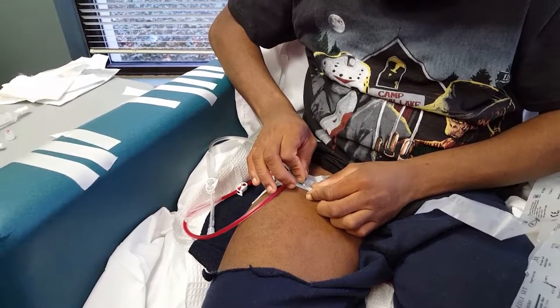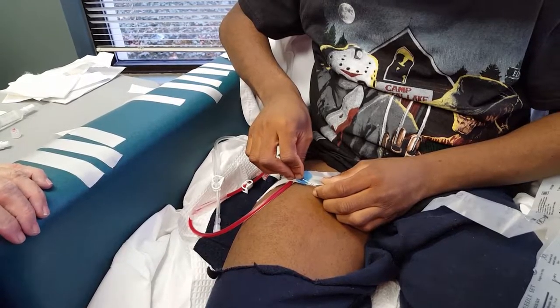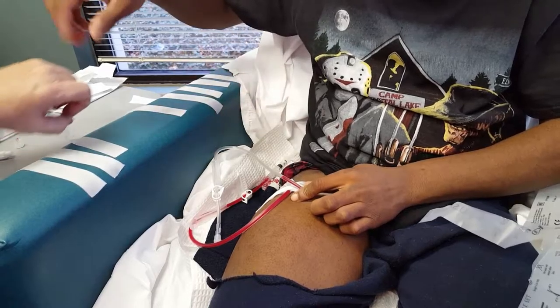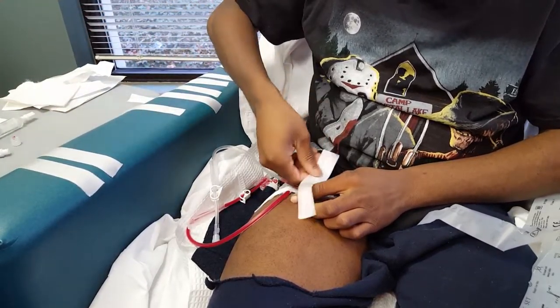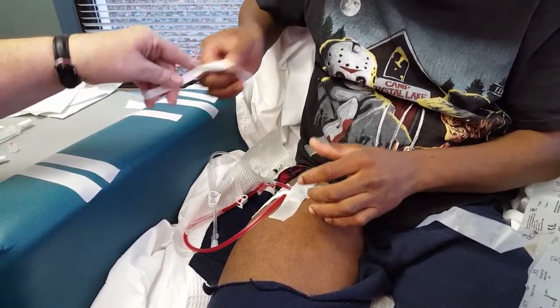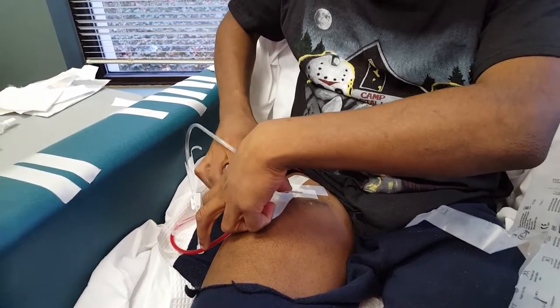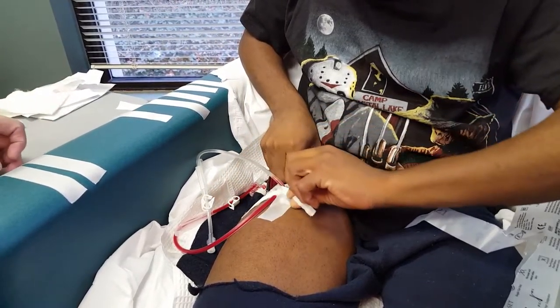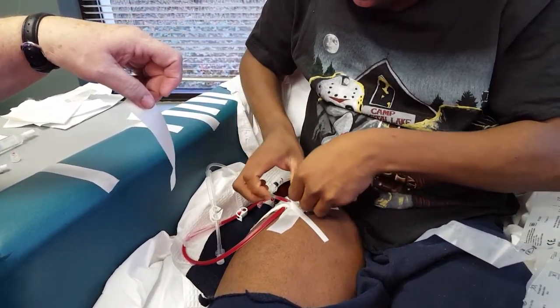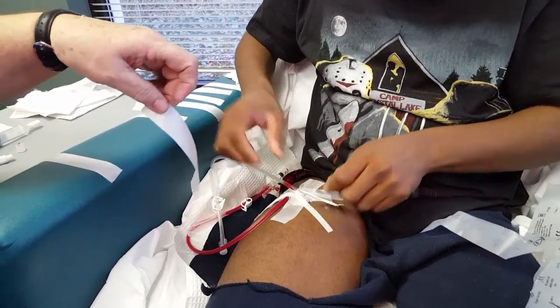Did you get it? Then I just push it on in. Did you get it? Yeah. Then tape it down. There's your tape. Good job. See how good he does? That's all right, because you're going to have tape over it.